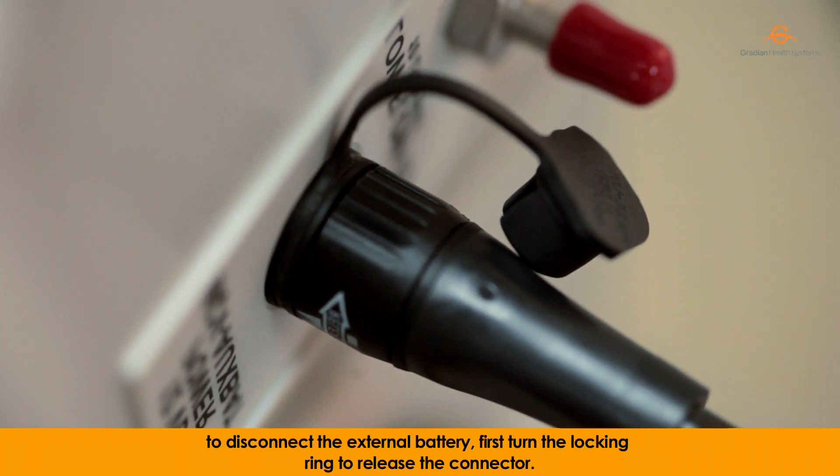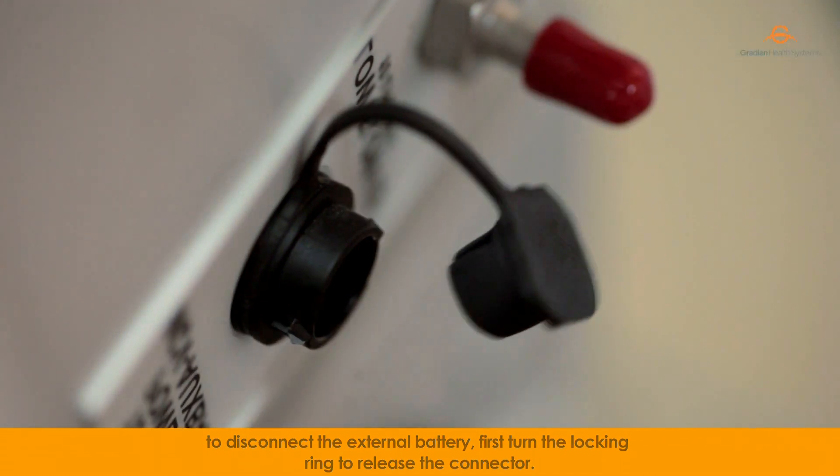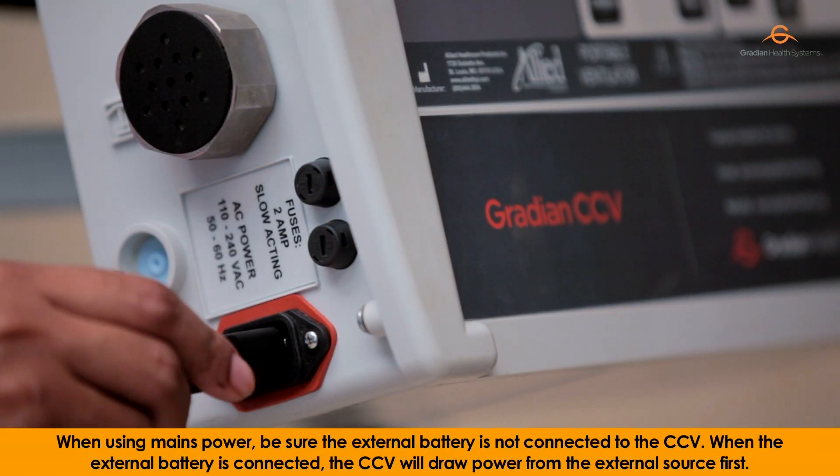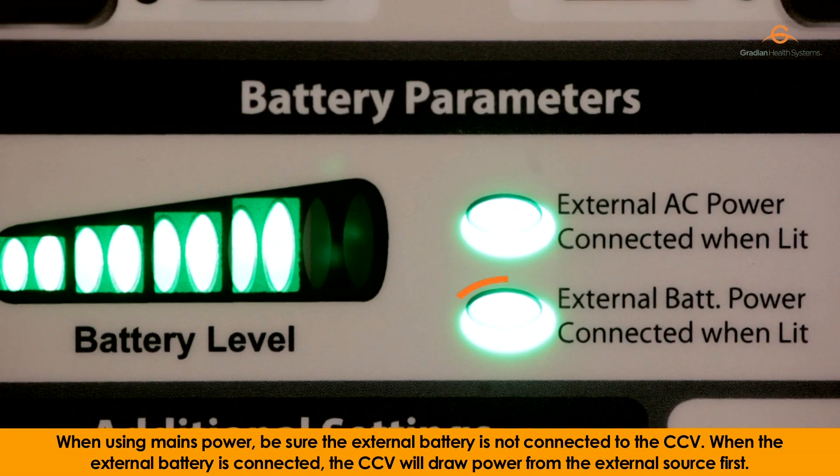To disconnect the external battery, first turn the locking ring to release the connector. When using mains power, be sure the external battery is not connected to the CCV. When the external battery is connected, the CCV will draw power from the external source first.